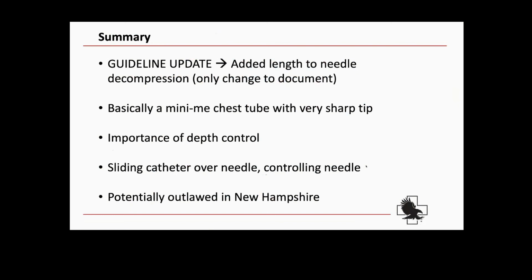So let's take a lot of time practicing our technique and going over these things in person, really emphasizing the importance of depth control, controlling the depth of the needle, and getting used to that Seldinger-type technique where we slide the catheter over the needle without moving the needle any farther in, and then removing that needle safely without, once again, losing control of it.